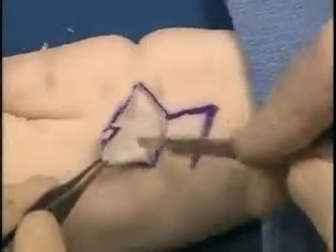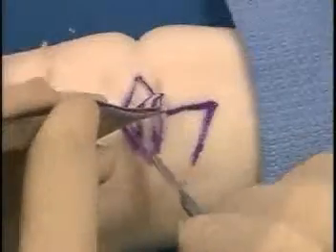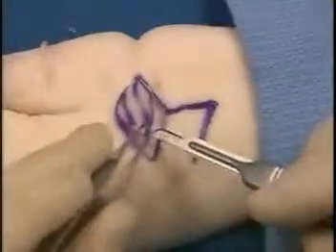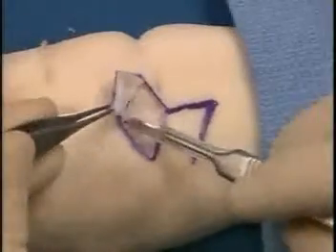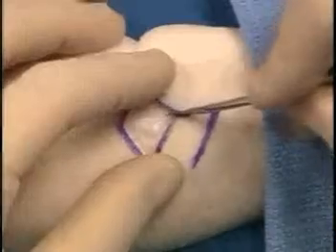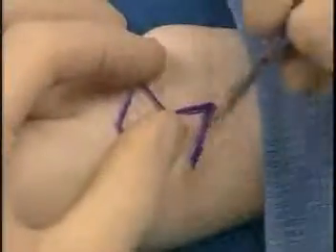dissecting it free with a number 15 blade down to the subcutaneous tissues. Notice also the other limbs of the flap are the same length as the parallelogram of the rhomboid flap. The angles are approximately 120 degrees and 60 degrees, and that's how the other limb of the flap is fashioned.